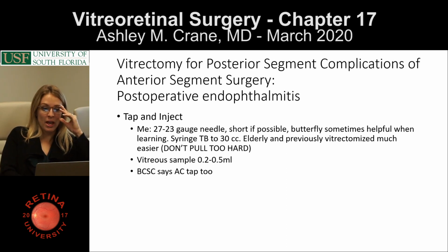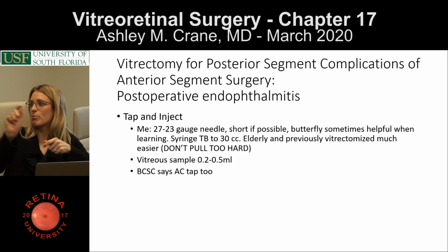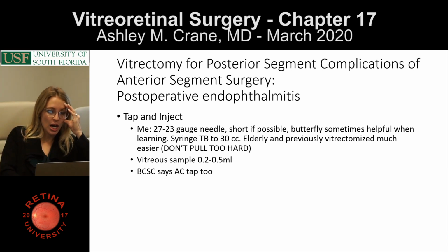So if possible. Sometimes when our first years were learning how to do these taps and injects, I would have them always use a butterfly. Although you can really collapse the tubing on the butterfly, it's nice that they only had to do one thing at a time. So one person would be pulling, one person would just be holding. So you guys can think about that when you're learning how to do tap and injects.